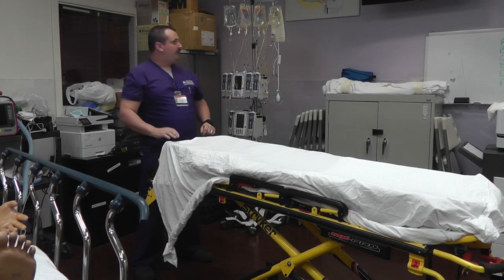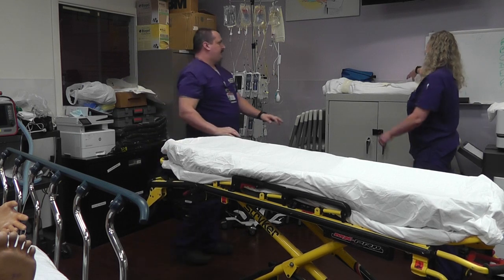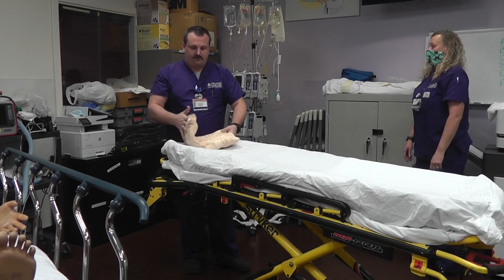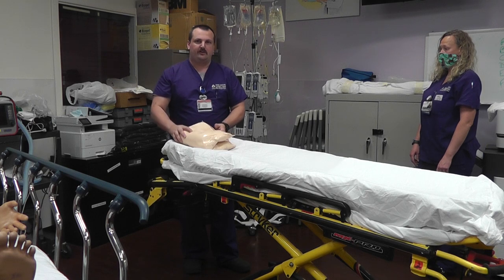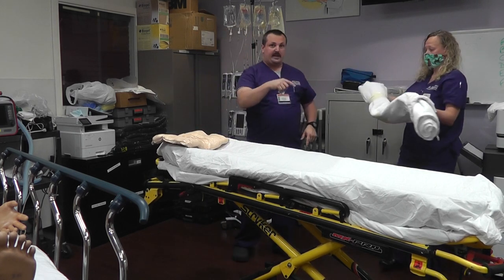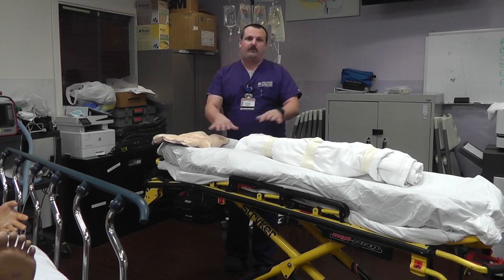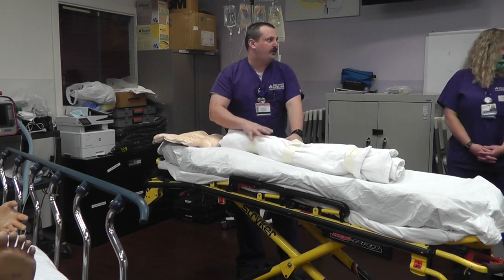Now our stretcher is ready to go. The next thing is to get a Z-Flow pillow available to put under the patient's head. This is the Z-Flow pillow — commonly seen in the NCCU and sometimes MICUs. It provides a very moldable surface to get the patient's head in just the right position, and it's not fluffy, so it gives you pretty good access to the patient's airway. We'll have it ready once we actually prone the patient. We also need to make a blanket roll using two to three blankets, rolled up and held together, ready before we go in the room. We lay this roll on the stretcher so that once we put the patient on it, they lay right on that roll — we don't have to move anything.